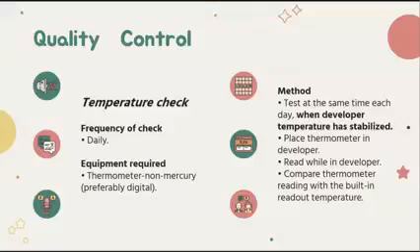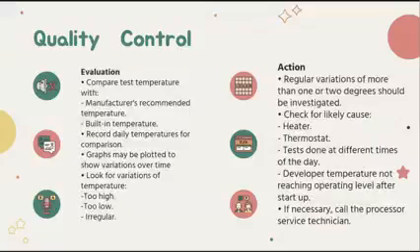for each processor chemical that is manufactured by your manufacturer, okay, there is parang specific temperature na i-recommend si manufacturer. So dapat it is compare ninyo ang result of your test temperature with the recommended temperature of the manufacturer, and dapat same sila, okay, or close enough siya. Okay, so to evaluate, compare test temperature with, again, manufacturer's recommended temperature or built-in temperature of the processor.